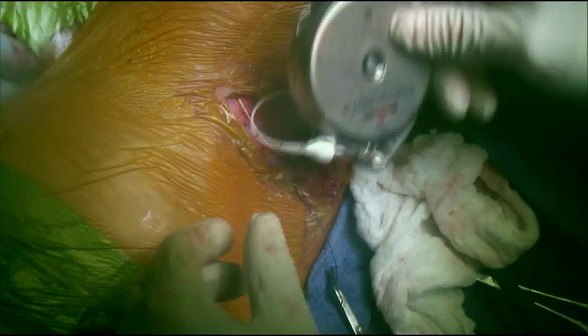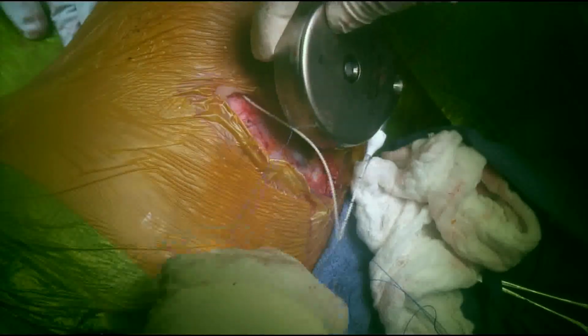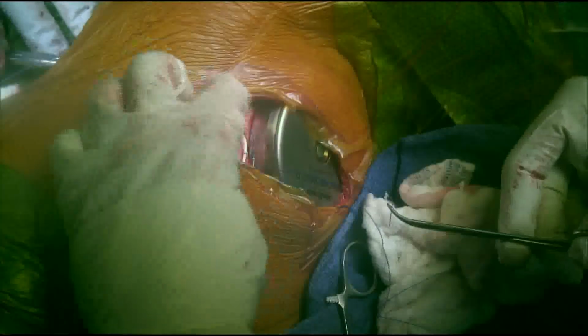Finally, the baclofen pump can be placed inside the abdominal pocket in the correct orientation, and the anchoring sutures can be passed through the anchoring corners of the baclofen pump and tied down to the abdominal pocket. Some surgeons sprinkle vancomycin powder into the abdominal pocket before inserting the baclofen pump. While there is no evidence to support this practice, we will leave it up to the surgeon's discretion.